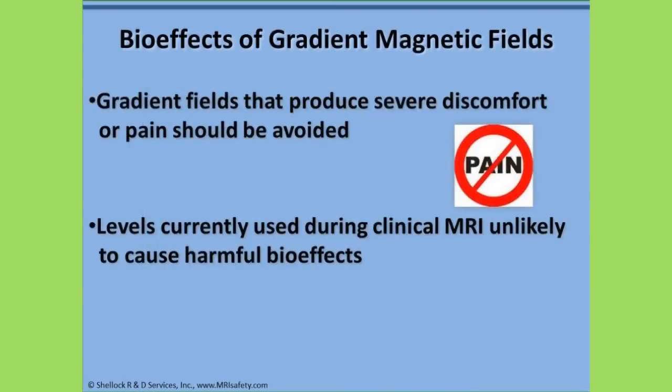During the performance of an MRI exam, the levels of gradient magnetic fields that produce severe discomfort or pain should obviously be avoided. Fortunately, at the levels currently used by clinical MRI systems, harmful biological effects associated with the time-varying magnetic fields are highly unlikely.